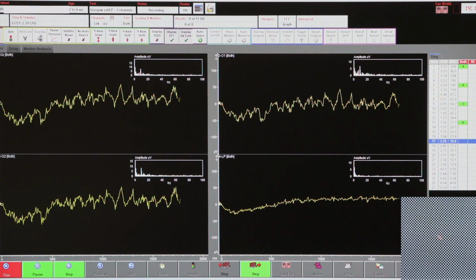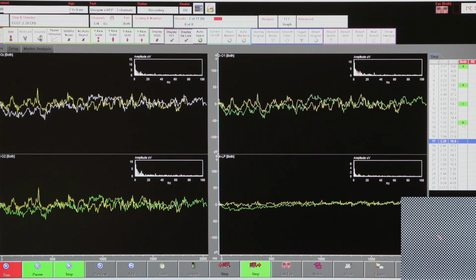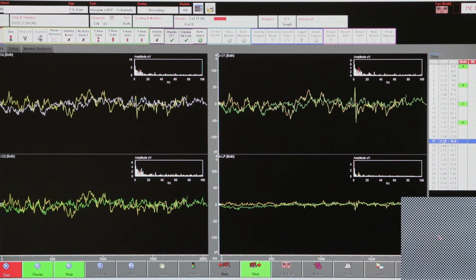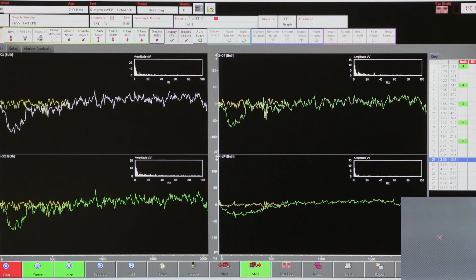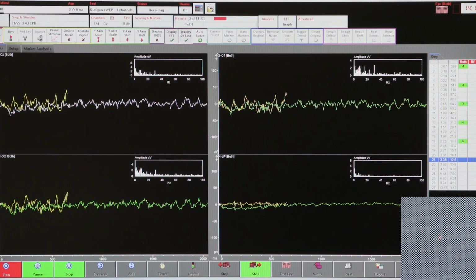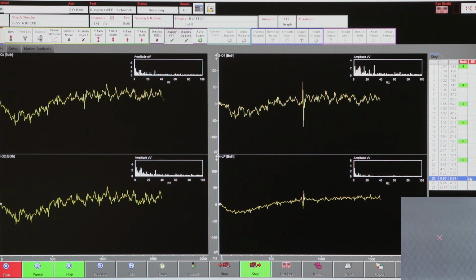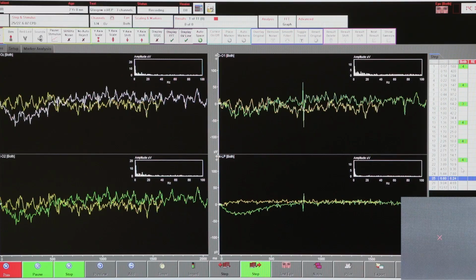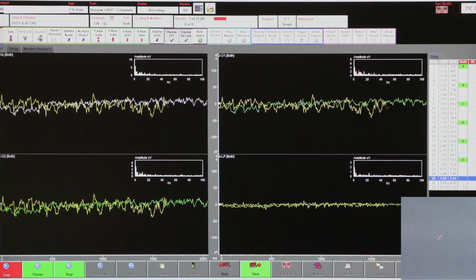The detection statistics have been designed to keep the overall false positive rate at about 5%. We flag check sizes in orange where the VEP was close to being statistically significant, but they are nonetheless treated as a no, as a red check size by the algorithm. So the test continues, stepping down in 4 here.